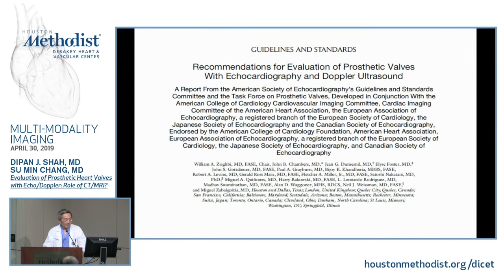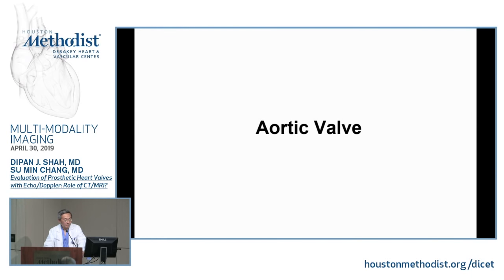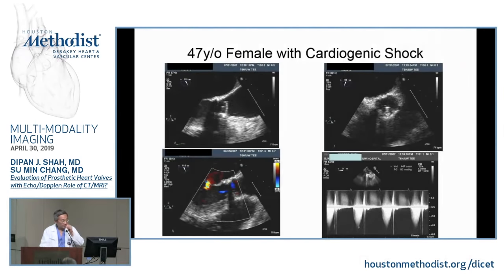So this is a guideline from the American Society of Echo about evaluation of prosthetic valve dysfunction, chaired by Dr. Zoghbi, almost 10 years ago. It contains, I think, most of the information you probably need to know for basic evaluation of the common types of surgical prosthetic valve. So let's go through the aortic valve real quick.